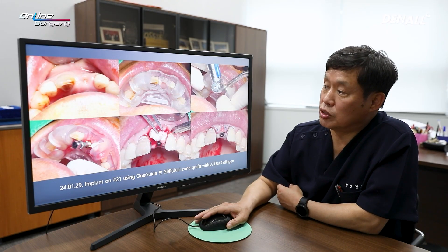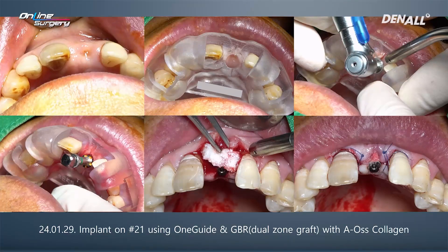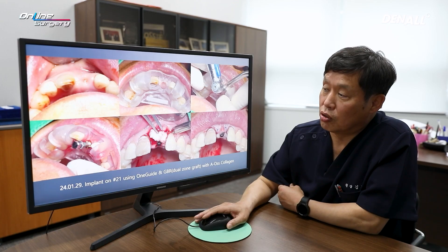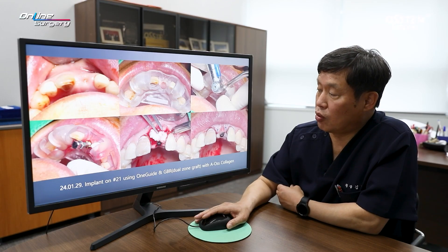This is the surgical procedure. You will see more details in the surgery video later. To prevent gingival shrinkage in the labial area, AOS collagen was used along with additional bone grafting, a technique we refer to as a dual zone graft. The procedure was designed to support both soft and hard tissue by adding sufficient AOS collagen for additional bone grafting before suturing.